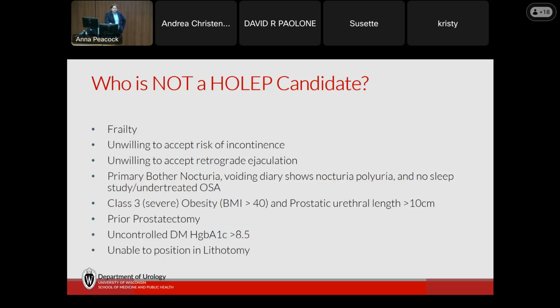This is kind of guidance about BMI more than 40. I know I've done plenty of patients with BMI higher than 40, but be careful, because you might not be able to get in. And that should not be in your first 5 cases, where you cannot get the scope into the patient. You're just starting to laser and hoping you can finish it.